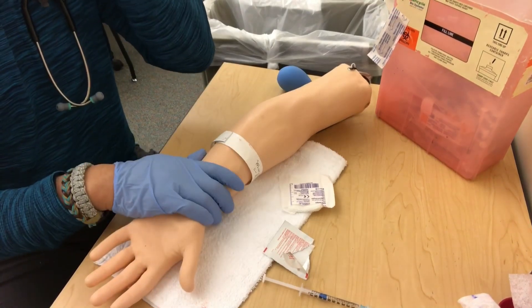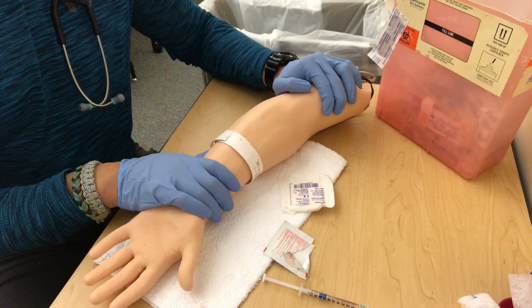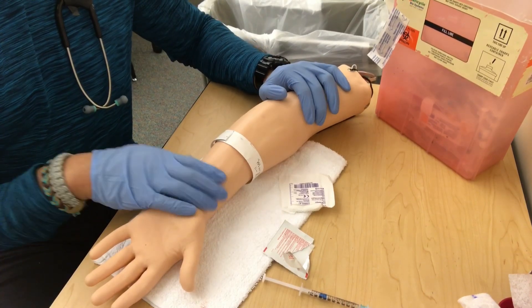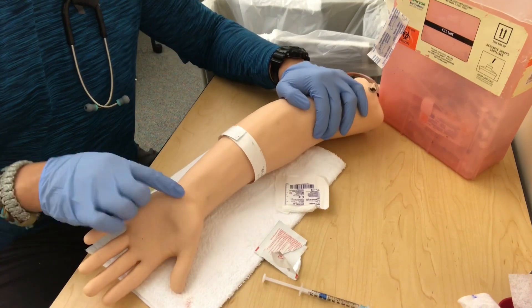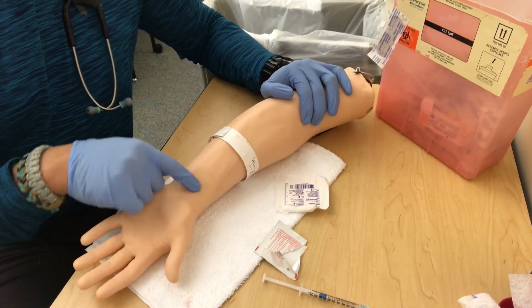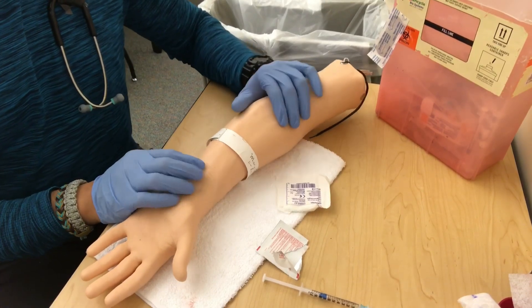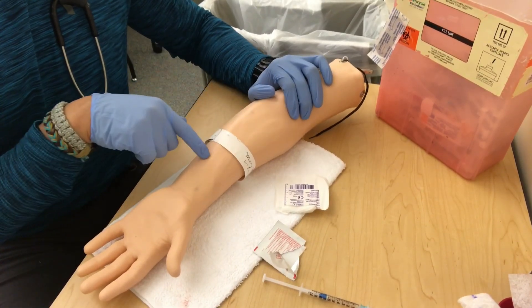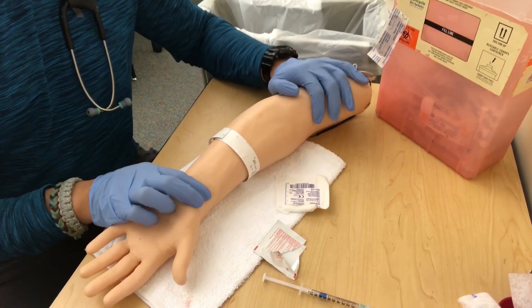Let's go get our blood sample. First thing about getting an ABG is location — we want to get this on the first try. ABGs hurt because we go through muscle, tendon, and nerves. It's not a vein puncture where we can see them and do a superficial poke — we have to go deeper. These really hurt.